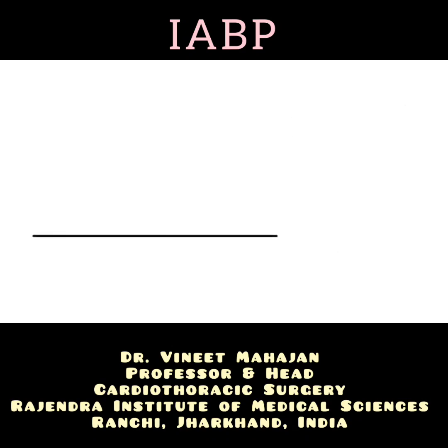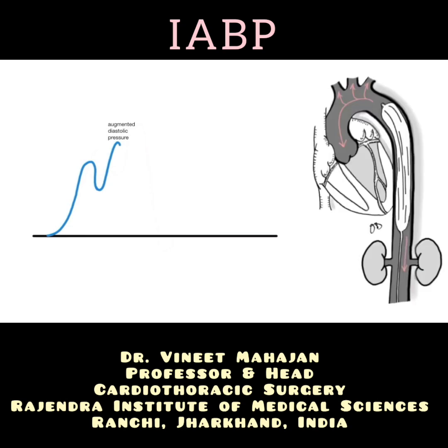A normal arterial pressure waveform is divided up into systole and diastole by the dicrotic notch, which represents the closure of the aortic valve. The intra-aortic balloon pump console analyzes the arterial waveform in search of the dicrotic notch to know when it's the right time for inflation. When the balloon inflates, an increase in pressure occurs. This is called the augmented diastolic pressure, and is responsible for augmenting blood around the aortic arch toward the coronary arteries to promote their perfusion.